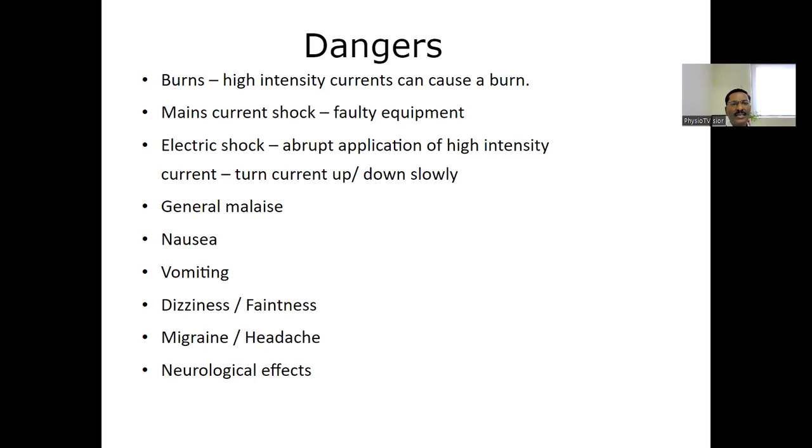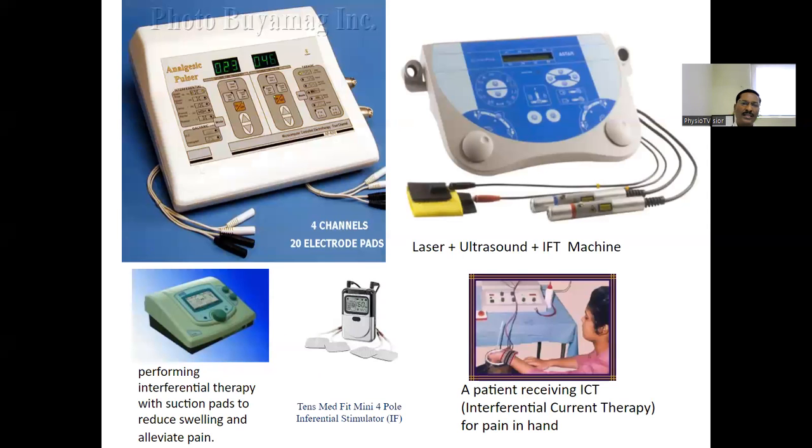There could be a generalized malaise, nausea, vomiting. Some patients, very few patients, experience this. And there are a few neurological effects which happen with the application of interferential therapy.